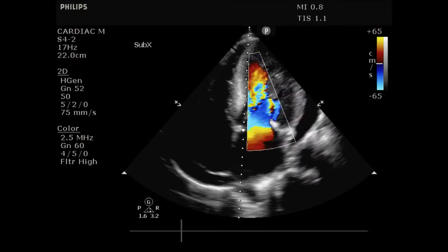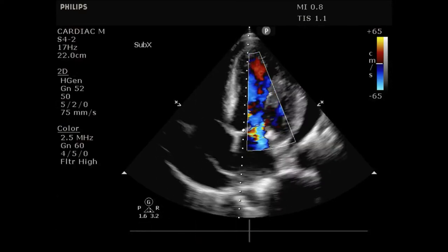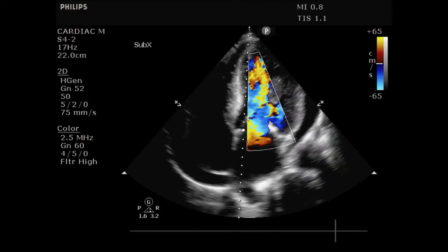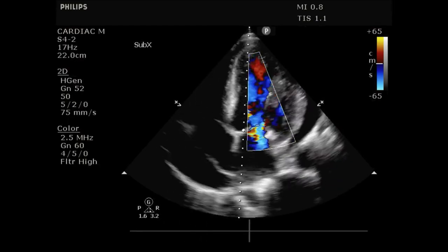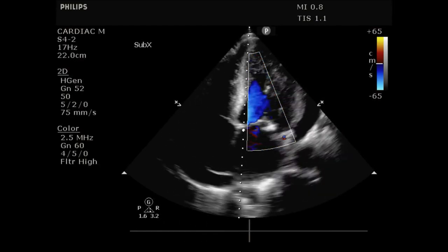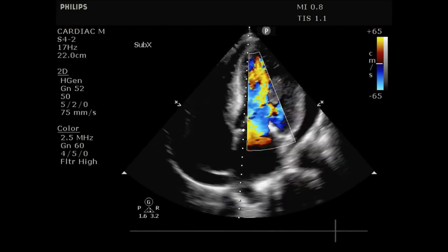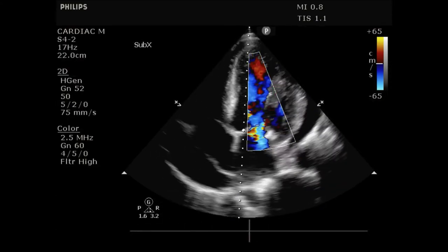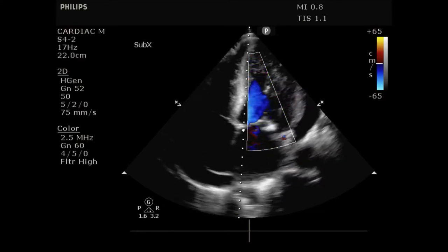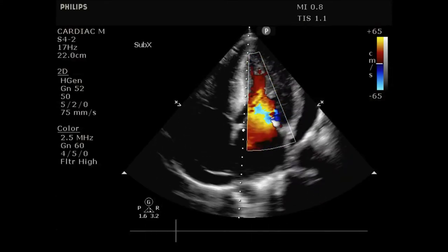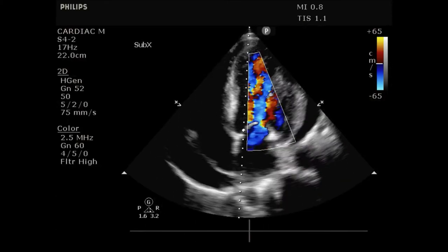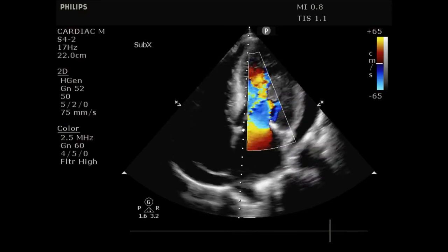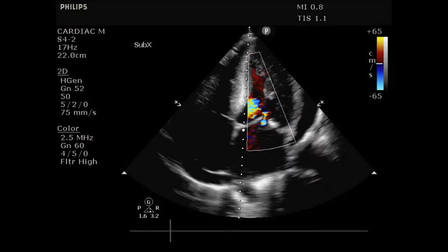Ignore the color flow on this one — it's not relevant here — but coming out toward more of an apical window, you can even see the effusion there, with the descending thoracic aorta again visible with the effusion tracking around it. So pericardial effusions can be seen in multiple windows.